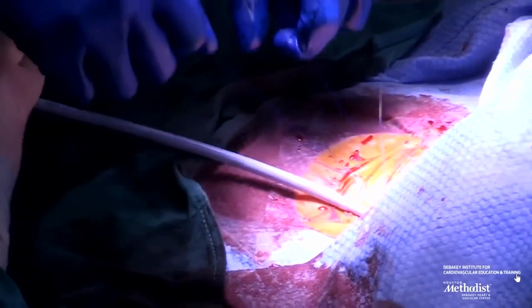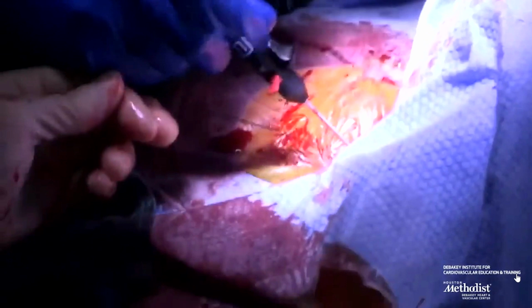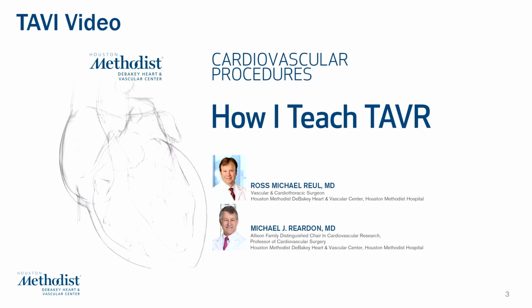You can see how we're tugging on those sutures that we placed originally with the ProGlide. Once it's not bleeding, you cinch them down. You bring the knot down all the way to the artery. And then you can do the same thing on the contralateral groin to close both arteriotomies. And that's how you do a TAVR.